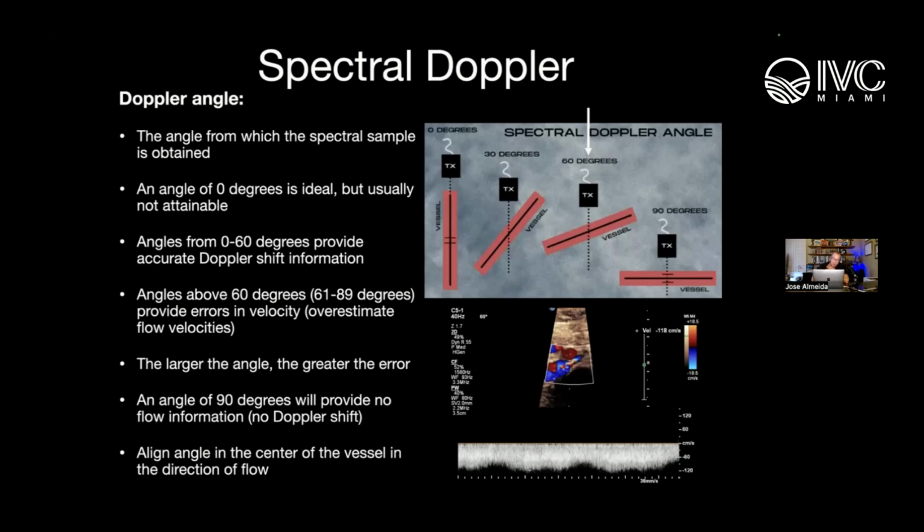But the point is, if you look carefully and you start looking at the numbers, your PW at 40%, color flow 52%, the 40 hertz at the upper left, there's a lot of operator input that needed to occur to generate this image. And then you're really getting a ton of information once you learn how to interpret this just by looking at the image.